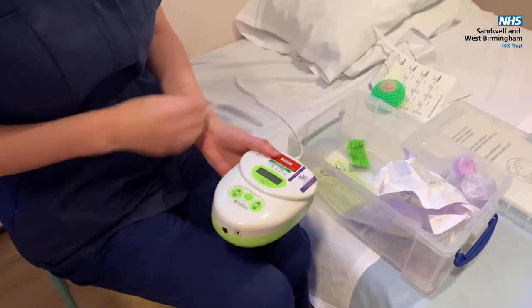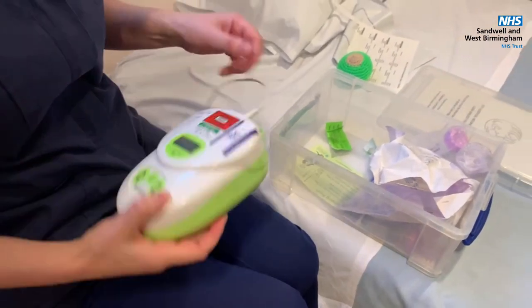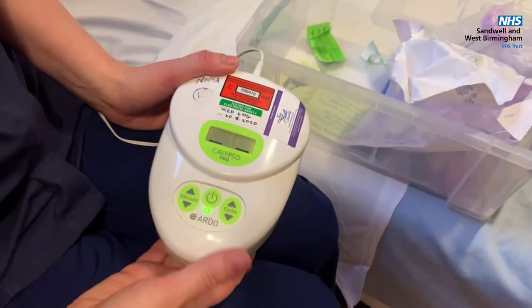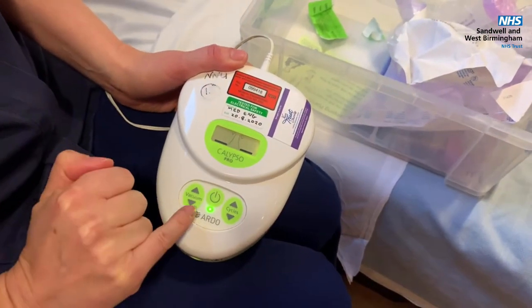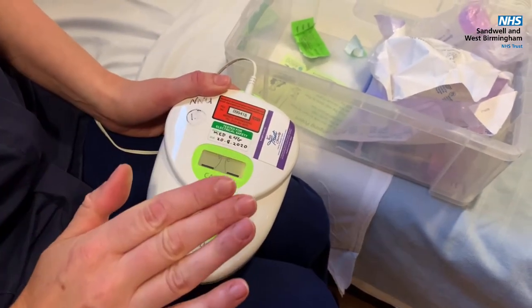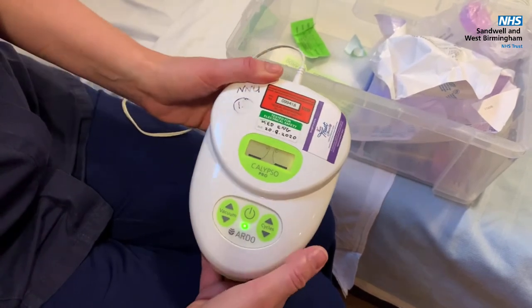You can plug the pump into an electricity supply or you can put batteries in as well. Switch the pump on and you can see the light comes on. Sometimes a little orangey light will come up here as well — that's not a problem as long as the pump is working. It just means the pump has been used a certain number of times.